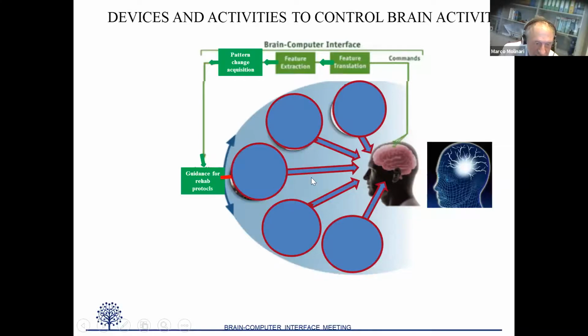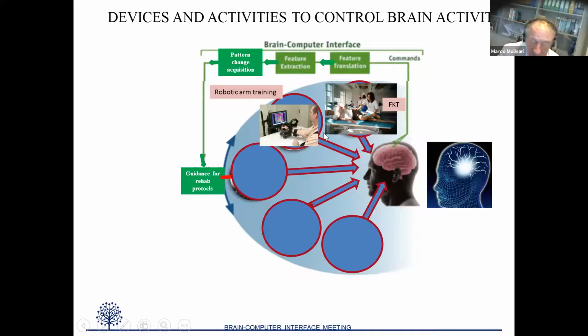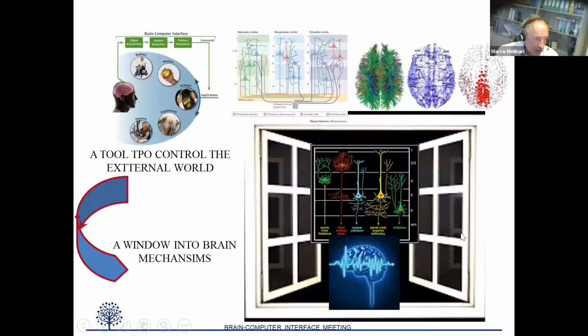A new idea is to change the direction of the activity and try to figure out if BCI technology can help us understand what is happening in the brain when I'm doing something like traditional physiotherapy, or robotic training, as I said before, with the Armeo or other devices for the upper limb, or during gait, like the Lokomat, or training with an exoskeleton, or with mental imagery, with activity I am doing with my volition in controlling mental states and mental activities. So the idea is to find out the possibility and the strength of EEG technology, mainly to discover and guide changes in brain connectivity.